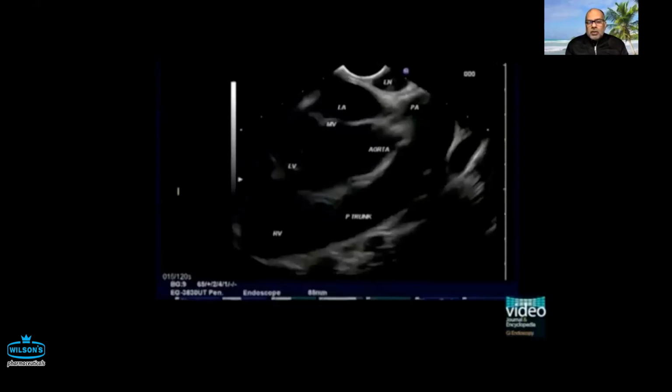One should know that. I think this video doesn't tell us, but you can look into the lymph nodes, because the lymph nodes are usually in the subcarinal region, and also near the GE junction. They are just above the liver, which is station 9, just above the diaphragm, and near the azygous vein. So those lymph nodes are sometimes sampled, and they're important.